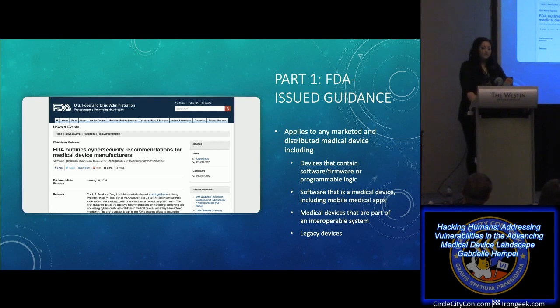The guidance is generally for medical device manufacturers and applies to any marketed and distributed medical device, which includes devices that contain software and firmware or programmable logic, software that's a medical device, which includes mobile medical apps, medical devices that are part of an interoperable system, and legacy devices, aka devices that are already approved on the market and in use.